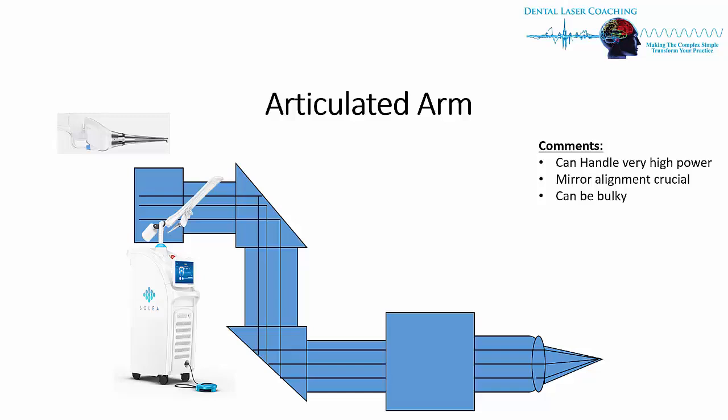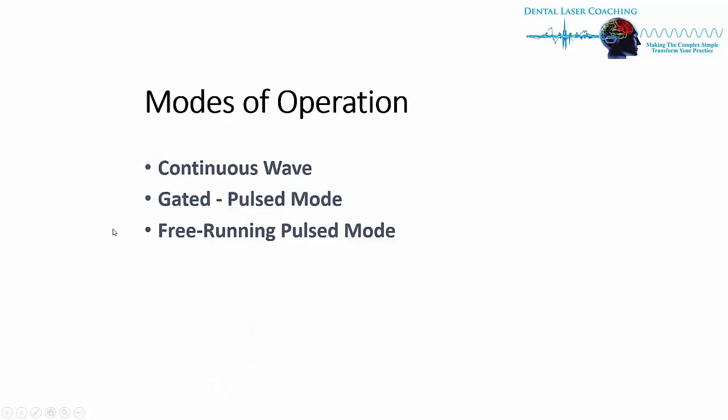And this is what they call a galvos, and they're using computer-aided preparation to basically now be able to use a CO2 wavelength to cut hard tissue, which is quite exciting. So that's just an example of an articulated arm.